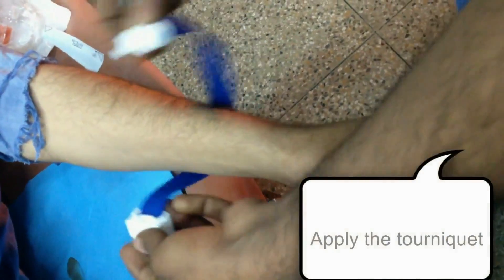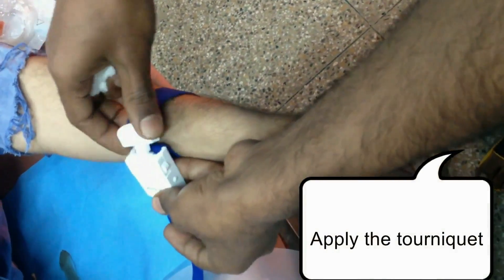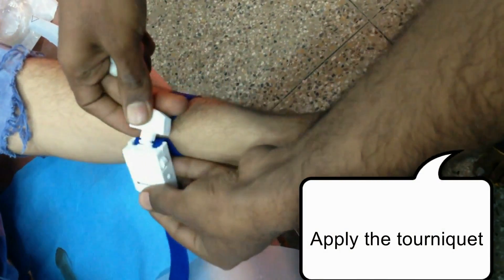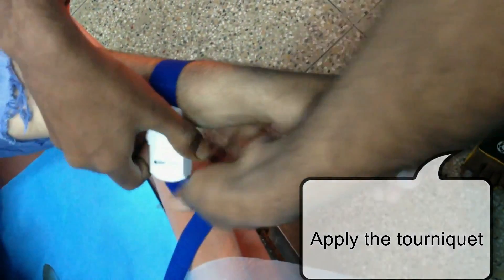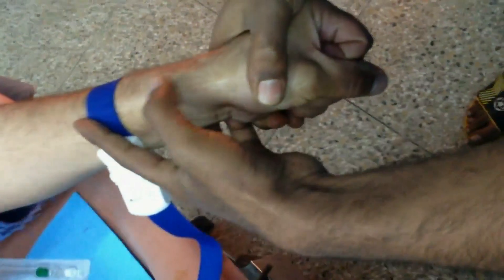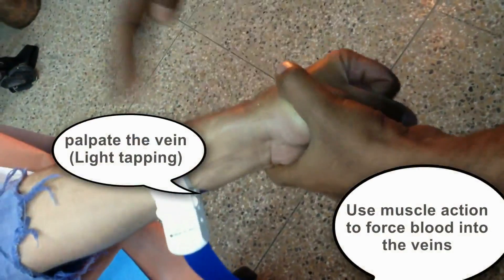Let's start the procedure. First, choose an appropriate site for the cannulation and then apply the tourniquet. I was supposed to wear gloves right now, but I'm not wearing them. While starting any cannulation process, you should always follow the standard technique of wearing gloves. Now clean the skin with the alcohol swab and flex the wrist.